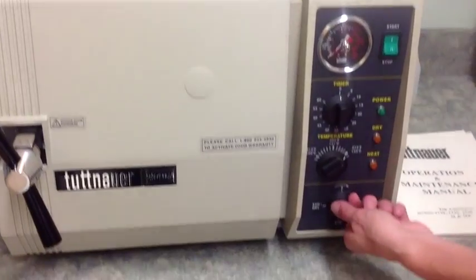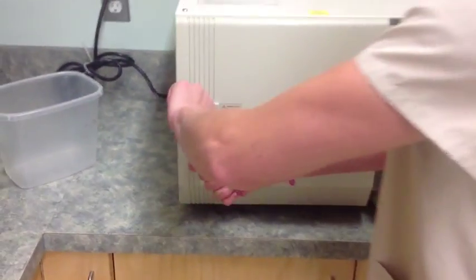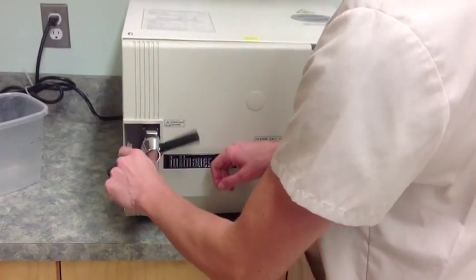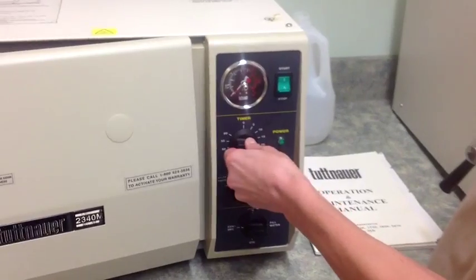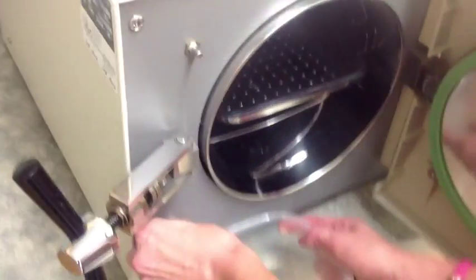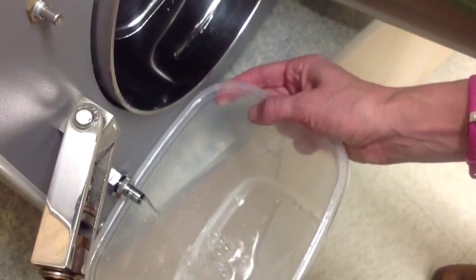When the timer reaches zero and your cycle is complete, turn the multipurpose valve to exhaust dry. Loosen the door and prop it open about 2 inches to allow drying, and set the timer for 20 minutes.